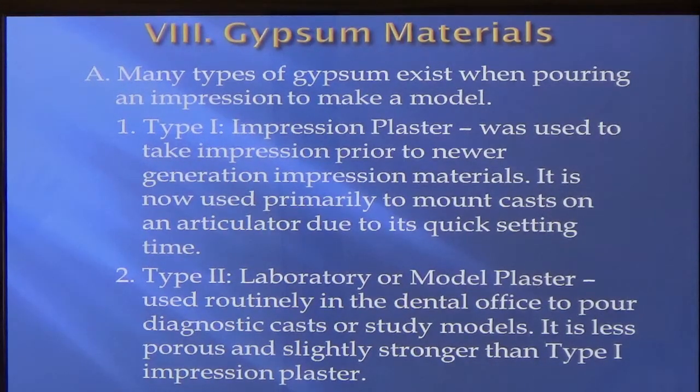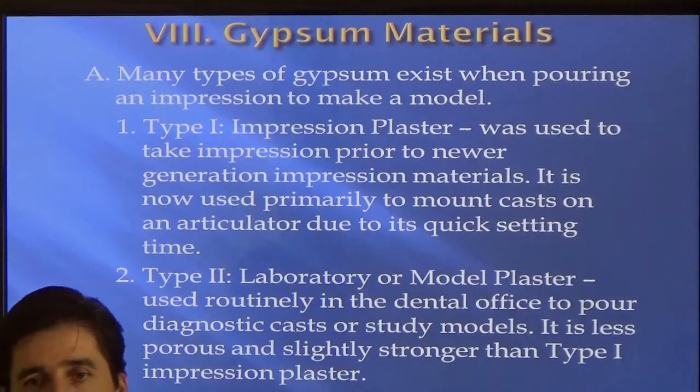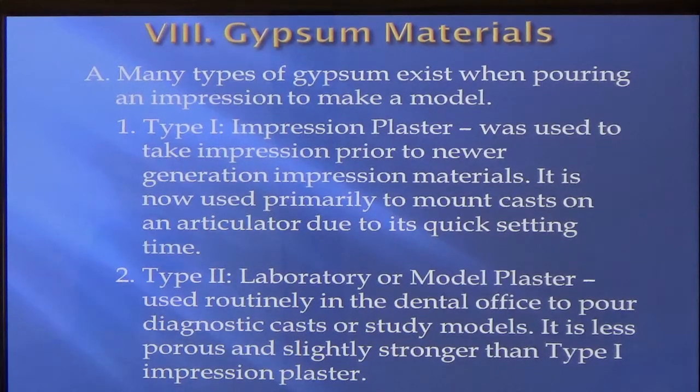But what's the important part between silicone and Alginate? Alginate is what? Basic. Basic, yeah, good. That's a good way to remember. Very basic, gives you not too much detail. And you don't have much time to work with it.